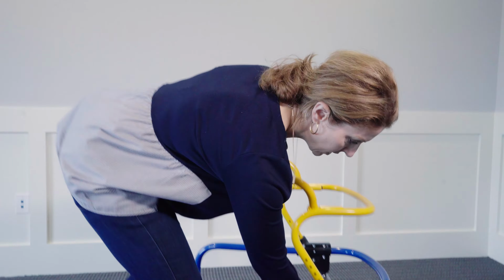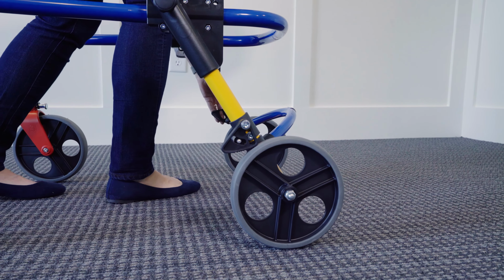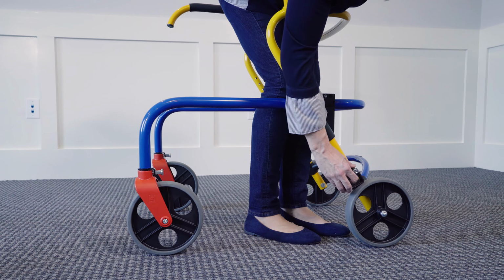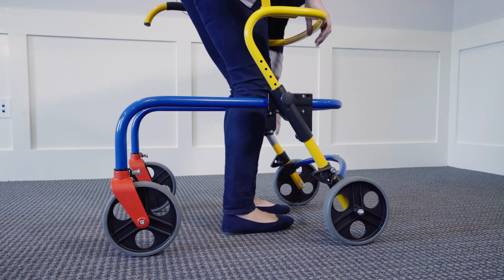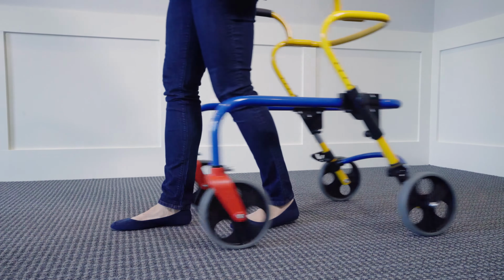By activating or pushing and depressing this pin, you push that down on both sides. There's another one over here. So essentially what that does is if you're going up a hill, this walker won't roll away from your patient or your loved one. But if we just depress that pin and lift this up like that on both sides, now the walker can roll any direction.